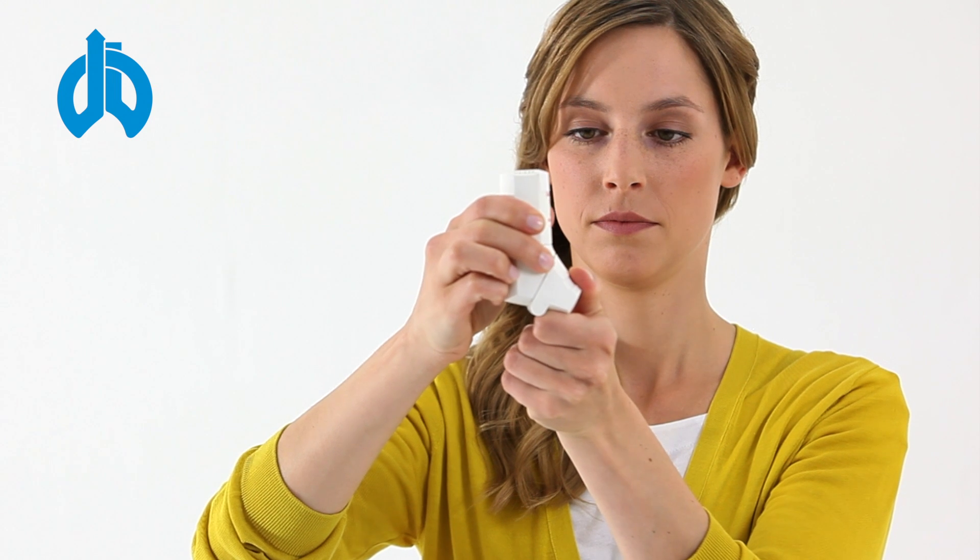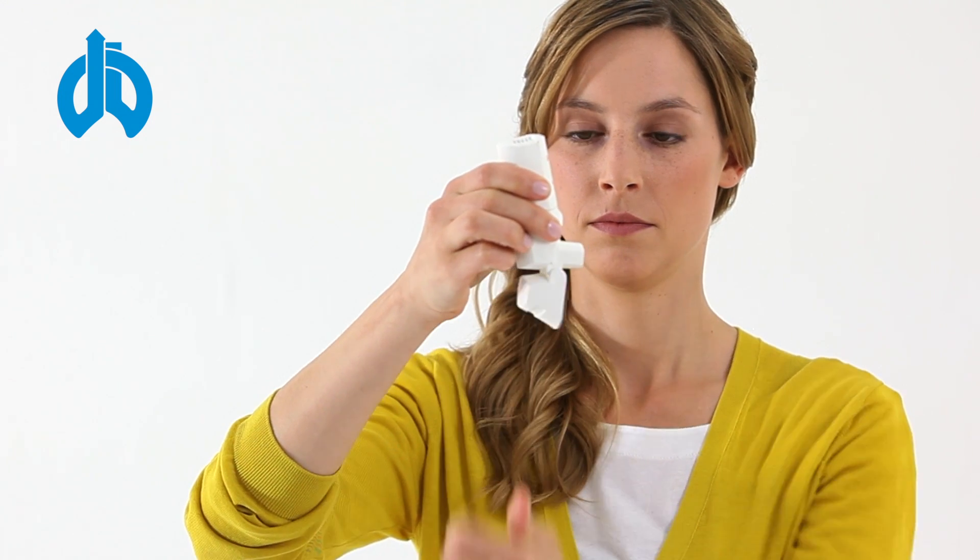Please sit upright. Remove the protective cap from the mouthpiece, which is best done by pulling the cap downwards with your thumb.